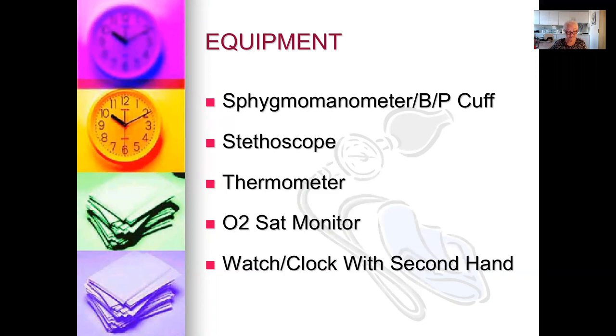It is the same as if a person sees a spill on the floor. The person who sees it should clean it. Usually staff at night take the equipment to the shower room and clean whatever the clients are using so that it can be ready in the morning for service. Disinfectant, brush, warm or hot water, and rags are used to clean the equipment.